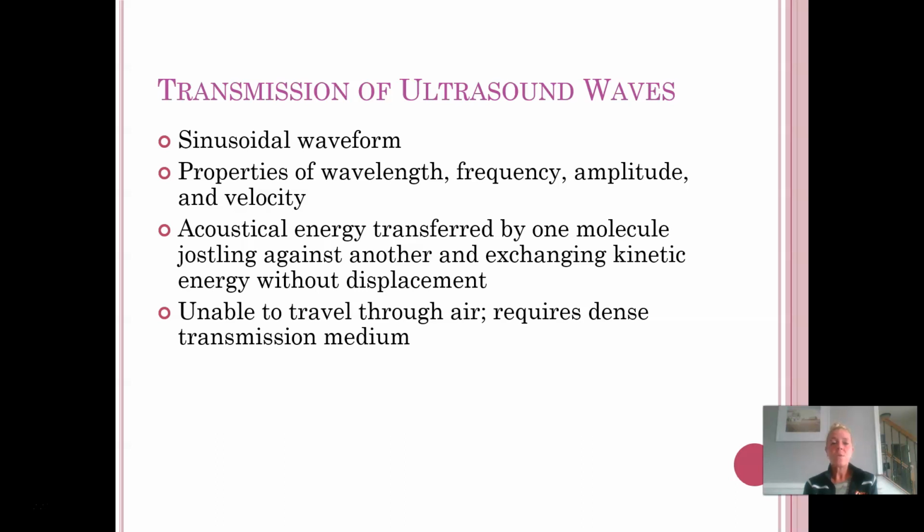But this acoustical energy is then going to be transferred from one molecule to the next by exchanging kinetic energy, but it does not cause any type of displacement. So the book talks about, think about like throwing a rock into a pond, into still water, and you have that sort of ripple effect that comes out. That's sort of how ultrasound works. It's going to be sort of concentrated in the area to which you're applying ultrasound, but then you're going to get effects that kind of move away from your treatment area a little bit as well.